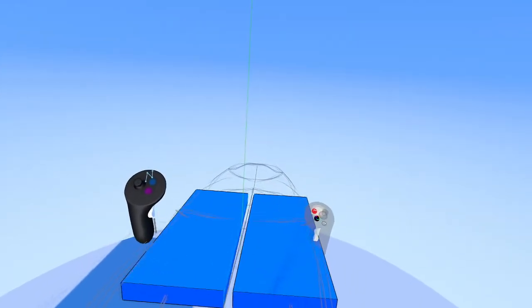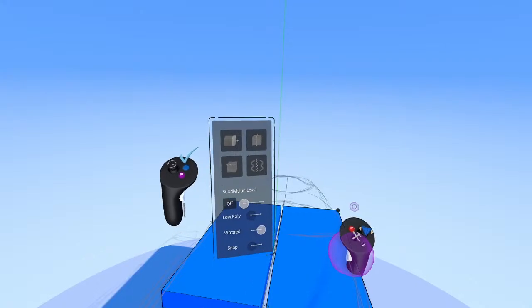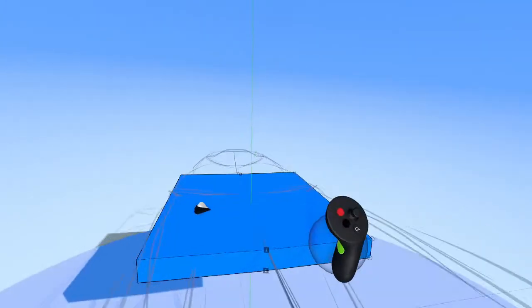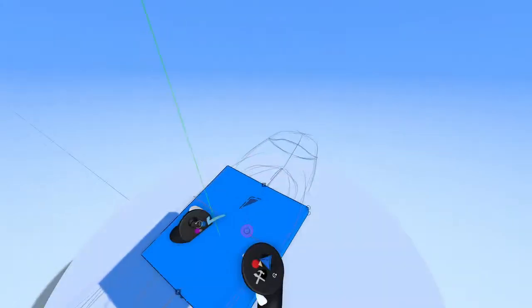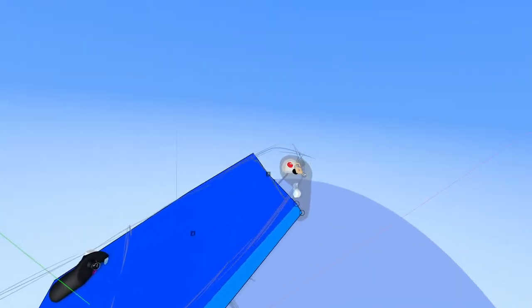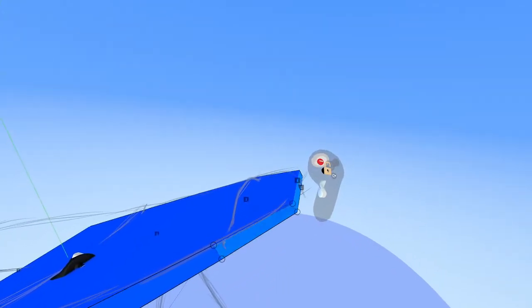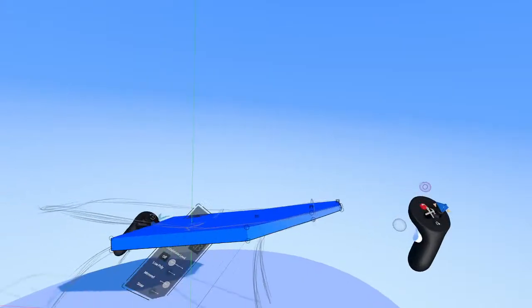So anyways, we're just going to move it here, grab it, put it into edit mode, move the face close to the mirror plane here so that it's connected, and start duplicating out these shapes here and really box in the shape of this medical table.